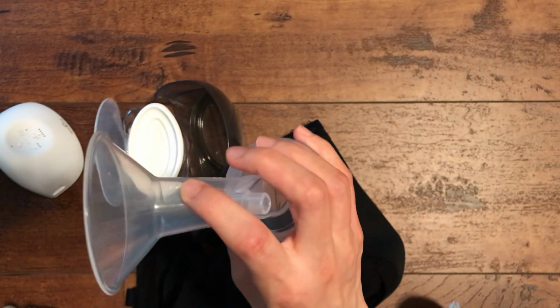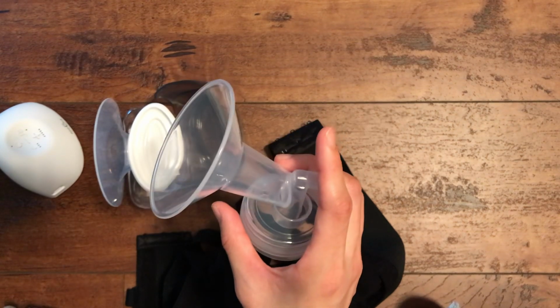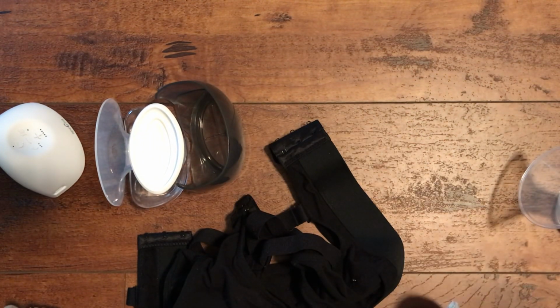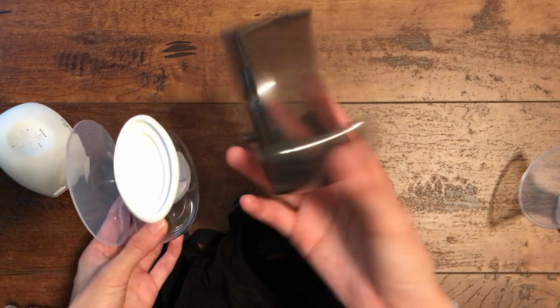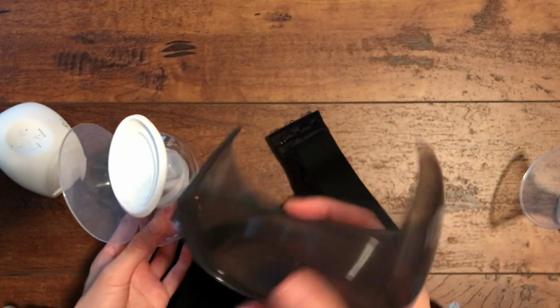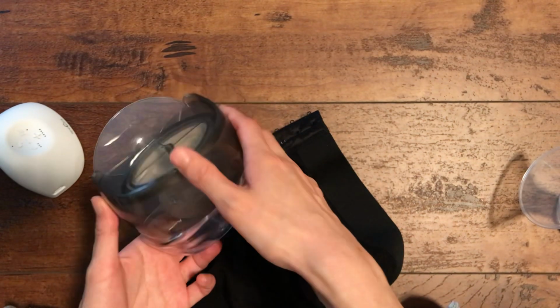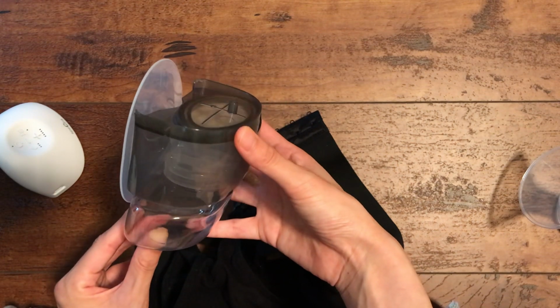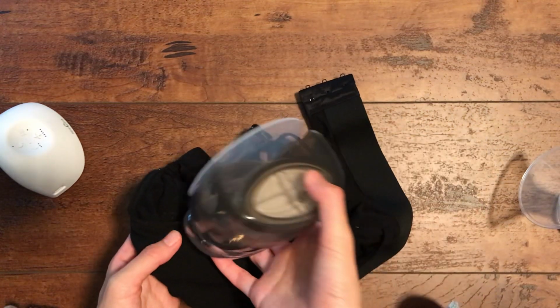You can look and see where your nipple's placed. You can adjust if you need to, make sure your suction's tight, so you can see your progress, and you can watch your bottle to see how many ounces you filled. But with this one, it's going to be in your bra, and this part is brown. I kind of wish it was more translucent, but this part is brown, so you can't really see your nipple very well. It's not really see-through, and it's going to be placed in your bra, so you can't check your progress.